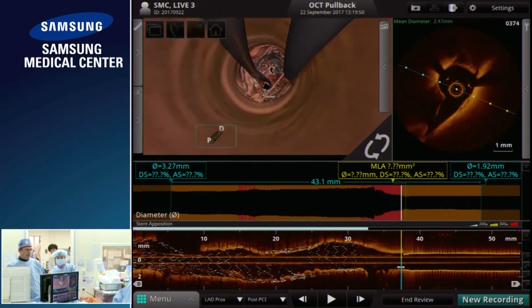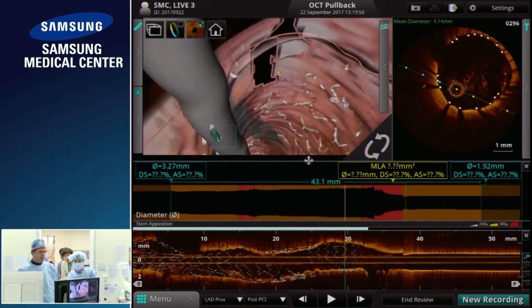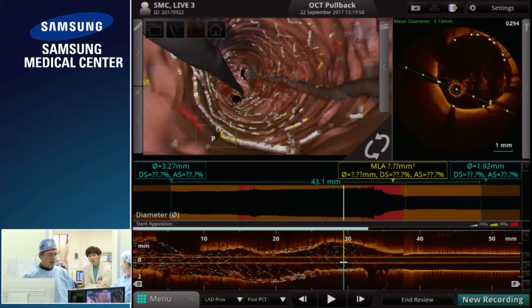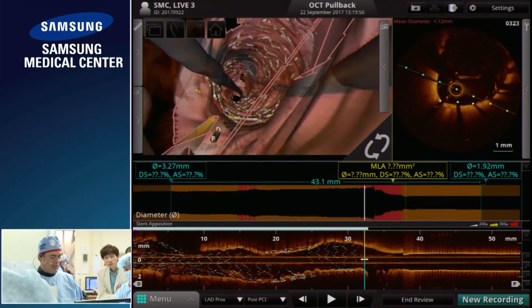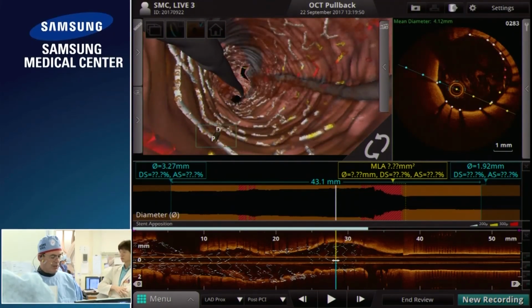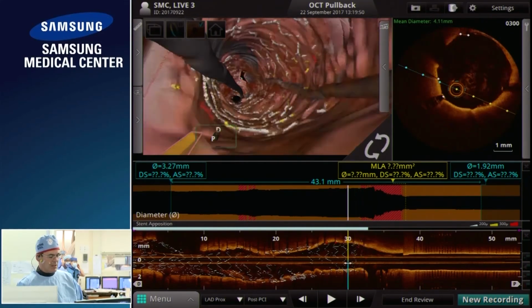Here we are, coming back into the catheter. So I'm coming out of the catheter, and I can see the edge of the stent. I can look all around, and that is all now beautifully apposed. Right. And so that's a very nice example, I think, of good sizing from the OCT. We've used that to dictate what post-dilatation balloon size or stent size we were going to use, and we've got confirmation of apposition using these preset parameters. I think it's a nice use of this software, and I think it really adds value to left main stem cases, in my view.